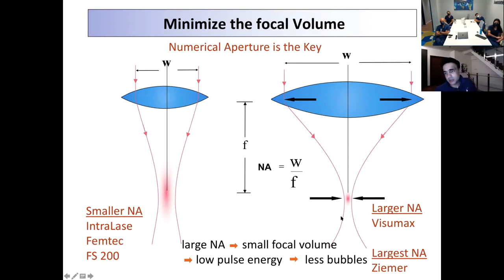Now, you may say to me, well, hang on, Jod, but maybe 4 or 5 microns makes no difference. And you're absolutely correct. It probably makes no difference when you're doing LASIK, because it's already talking about a 4 or 5 micron deviation. But when you start to cut lenticules within the cornea, then shape becomes a much more important issue, and you must be more accurate from there as well.